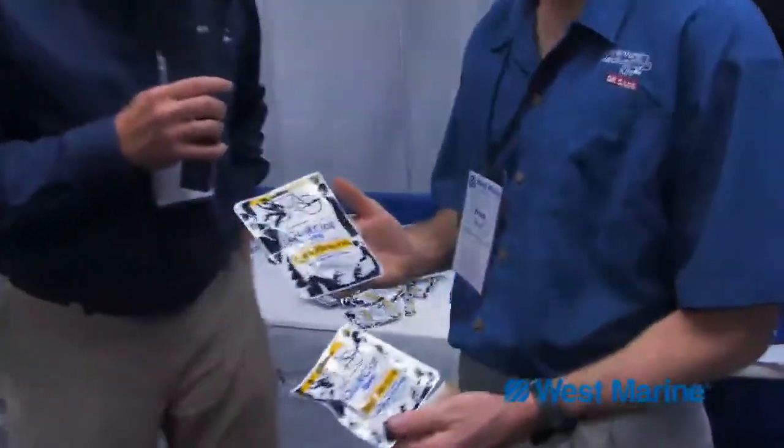Chuck Hawley from West Marine, and today I'm talking with Frank Meyer. Frank is the president of Adventure Medical Kits and he's got a new product he'd like to show us. This is the Quick Clot. What does the Quick Clot do?